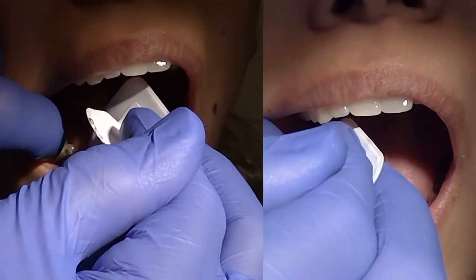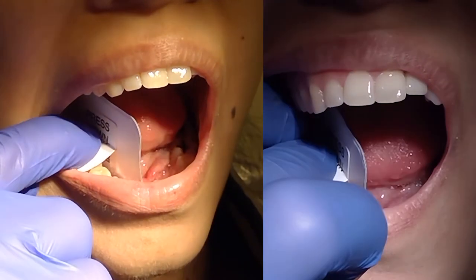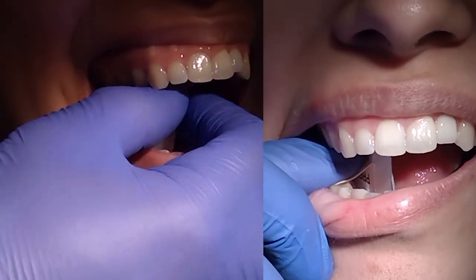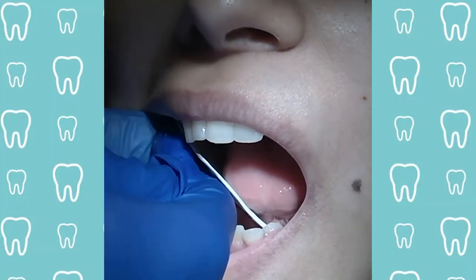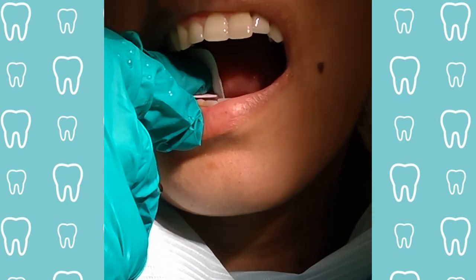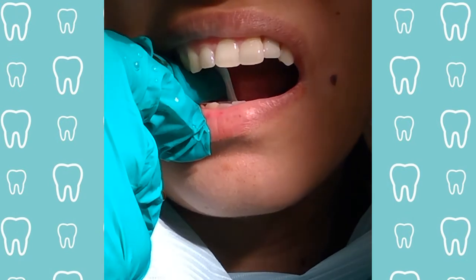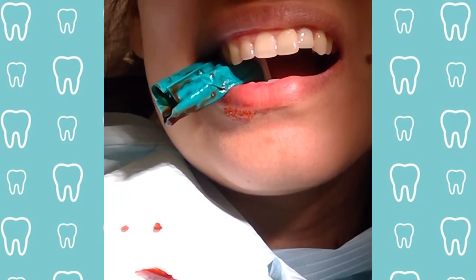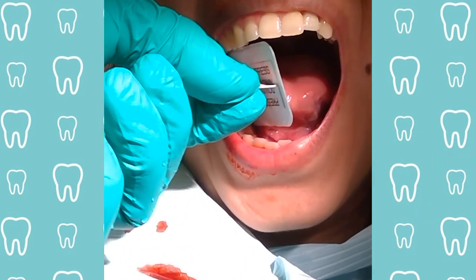Here's an example of doing the same technique, but definitely watch out — sometimes the patient may bite down and catch your finger. Another thing to watch out for is that the patient may offset the film and bite on the film itself instead of the bite wing tab. If they accidentally bite down on your finger, sometimes the patient may not want to let go. Just nicely retrieve the finger and continue on with the x-rays.